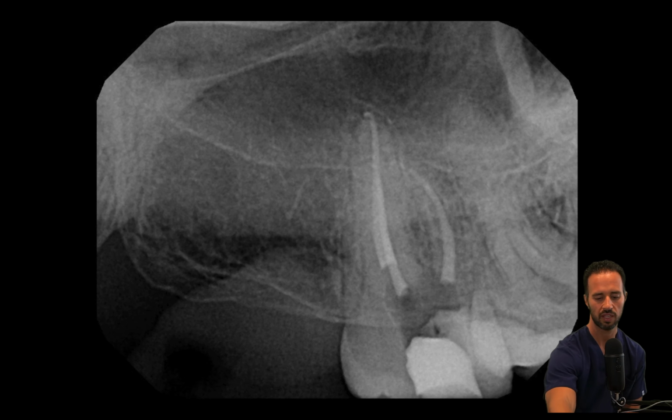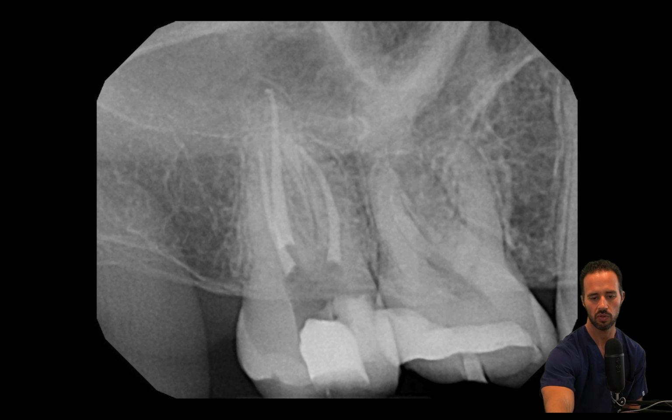So the rubber dam was removed. Our post-op radiograph is taken. In this case, we took 2 post-operative radiographs because we had some overlapping in the first one. But we can see here we have nice root fillings all the way to the apices, nice compact root fillings as well, and just a neat case without too much struggling, without too much time involved.